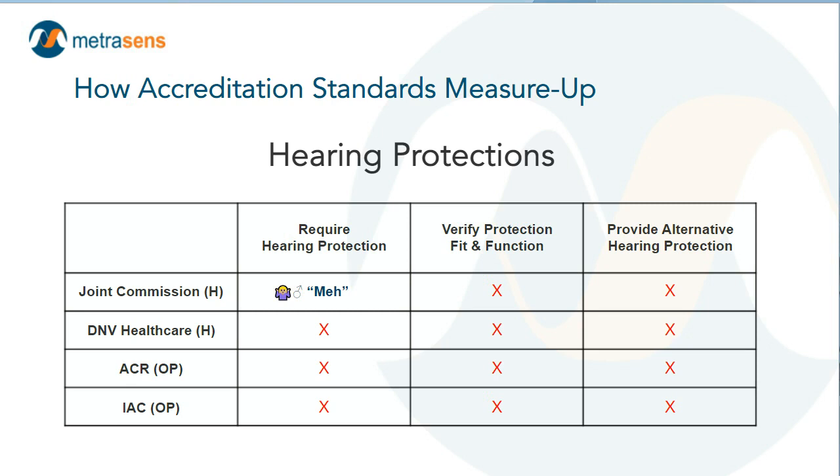This is embarrassing, guys. These are the most frequent ways that patients get injured in MRI, and these are preventions that can be demonstrated to dramatically reduce the likelihood of these injuries, and yet they are not required elements in ostensibly MRI safety standards for patient care.